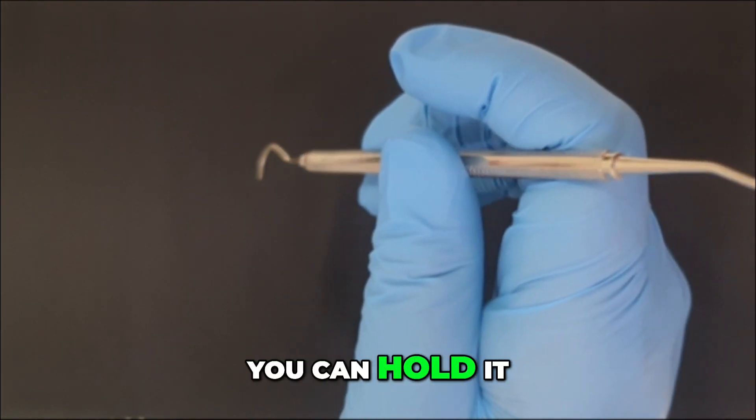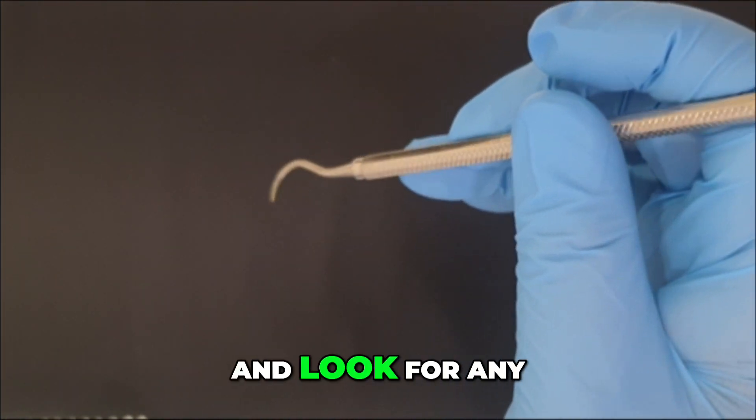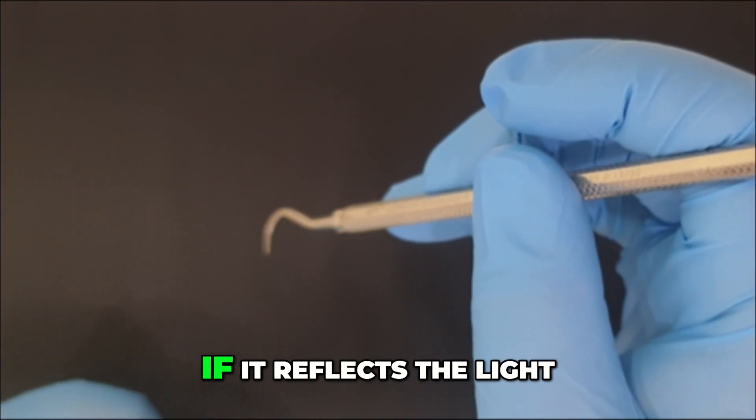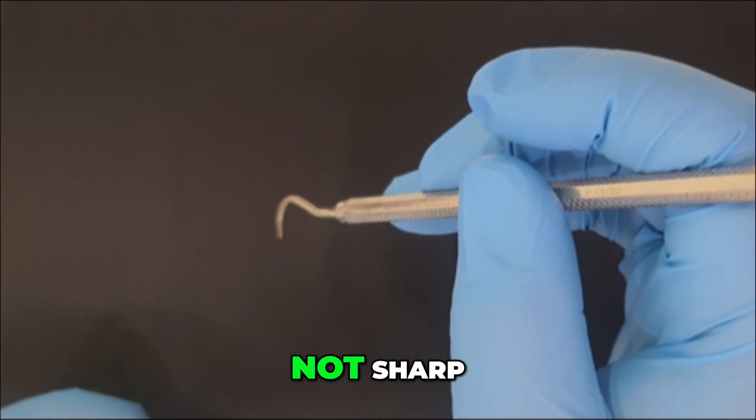One, you can hold it against the light and look for any reflection on the cutting edge. If it reflects the light, then the instrument is not sharp.